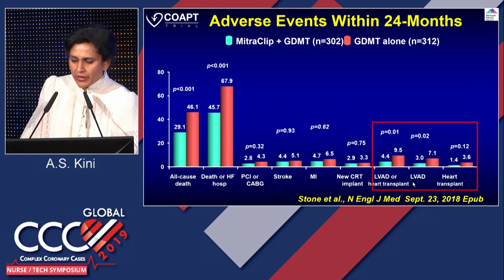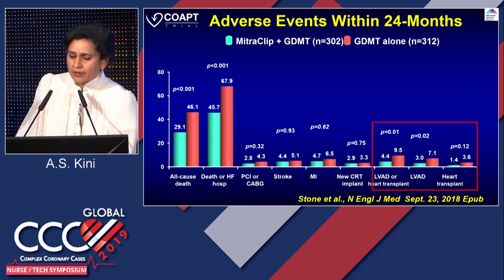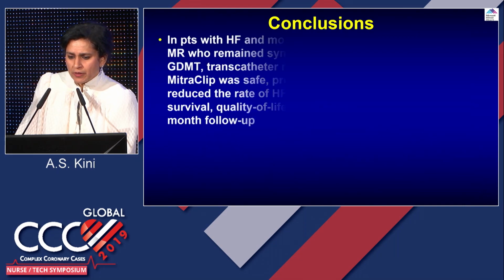So if you see here, what are we trying to show? That patients who have heart failure, we are talking that their need for heart transplant, need for LVAD, or either of the two was decreased once they became on therapy as well as when they went on clip. So this is something that everybody, I think, should take home as a message, that this therapy works in patients with heart failure. If they are on good medical therapy and they're still symptomatic, they should be referred for mitral clip therapy.